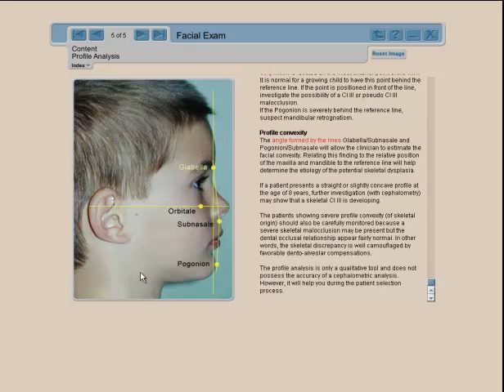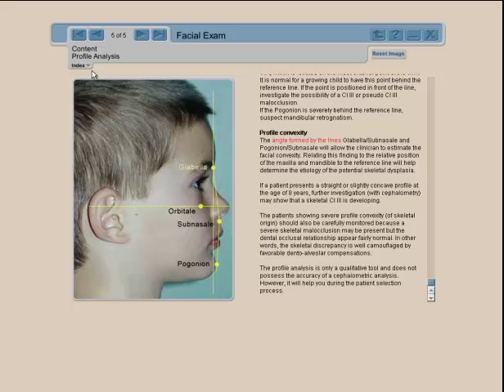This is a simple and fairly efficient way to learn how to perform a profile analysis. Obviously you have to expand on the meaning of the convexity, but this is designed as a first guide to better understand what profile convexities or concavities are caused by or come from.